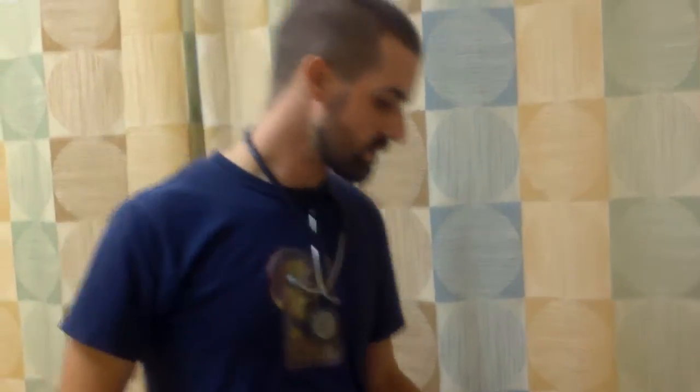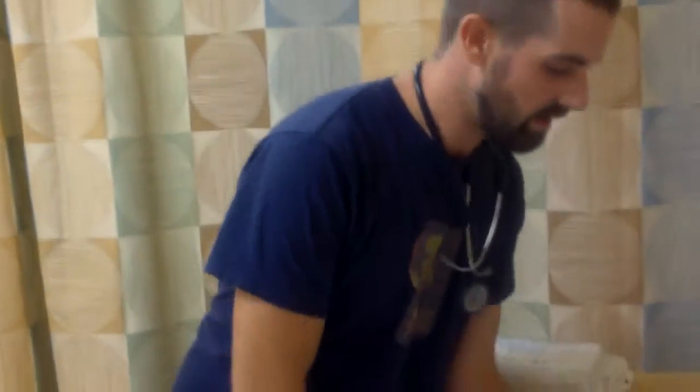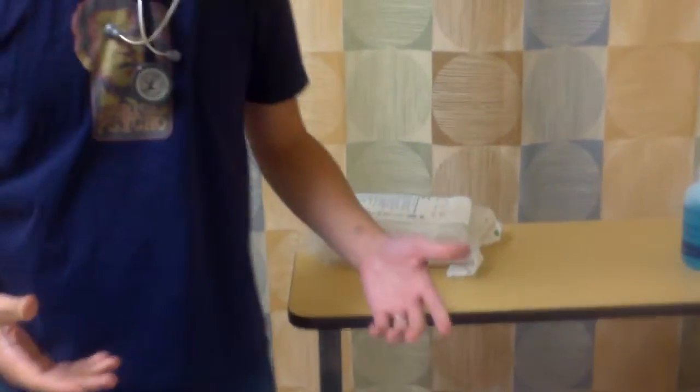Did that. And then I'm going to say that I would like to do a full abdominal assessment on you. Once I do that, I am then going to do a straight catheterization because I know you have some bladder problems that we need to look into. So once the patient is aware of the situation and the process, and compliant, then I'm going to begin. So then I'm going to start with the abdominal assessment.